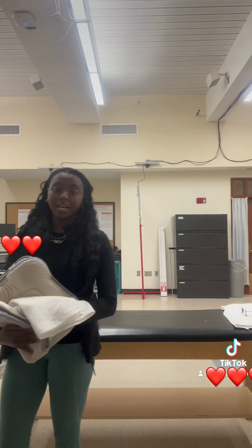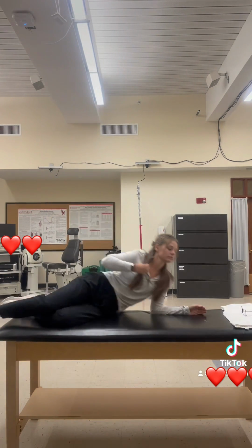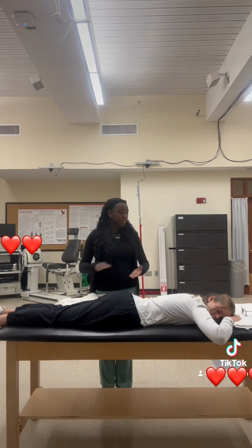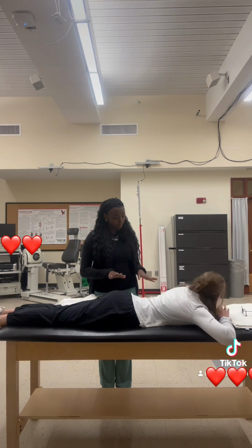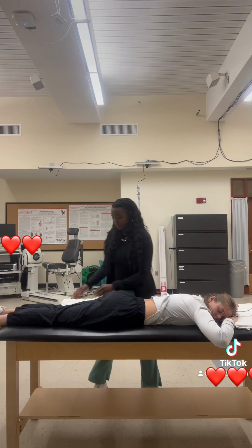To begin applying this modality, I'm going to ask that the patient lay on her stomach, as this is for low back pain. Before beginning any further treatment, I'm going to ask for consent to touch you. Yes, you're allowed to. Okay, for this modality, I will be lifting up the patient's shirt to avoid dampness.